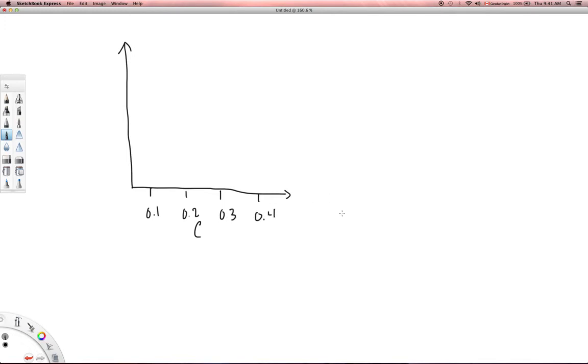And over here, we will make this the absorbance. Then I want to graph this out. Let's say that at a certain concentration, I know the concentration, and I shine some light through, I get 0.5 here. So put a dot there.